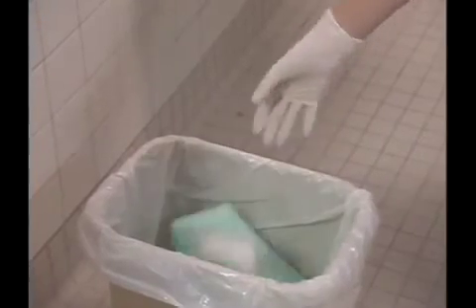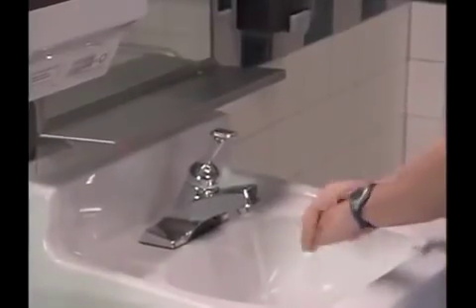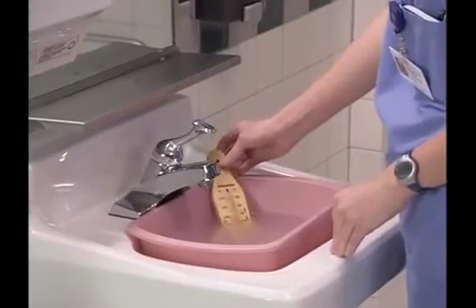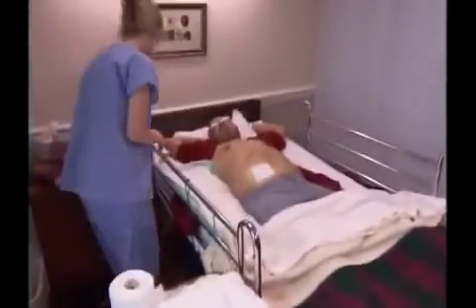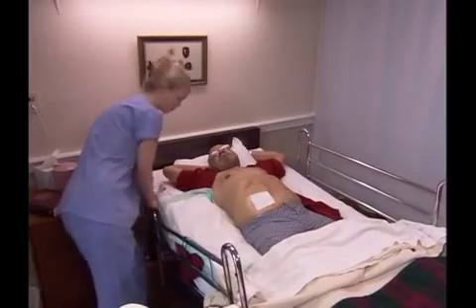Dispose of the ostomy appliance in a facility-approved waste container. Remove your gloves and dispose of them in a facility-approved waste container. Wash your hands. Fill the wash basin with warm water, 110 to 115 degrees Fahrenheit. Return to the bedside and place the basin on the overbed table. If the side rails are in use, lower the side rail on the working side of the bed.